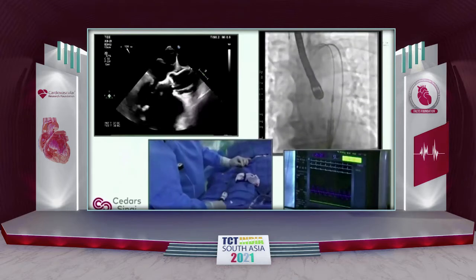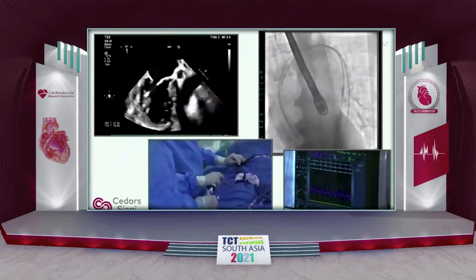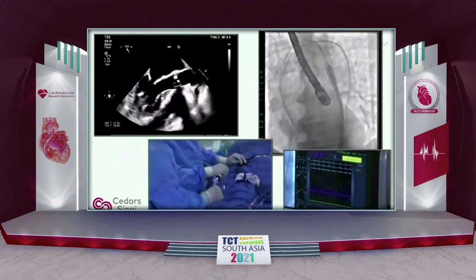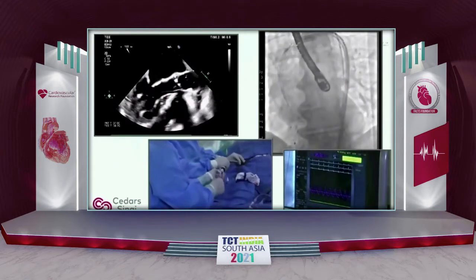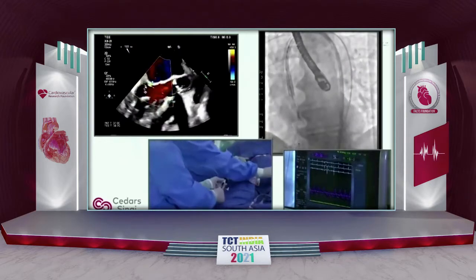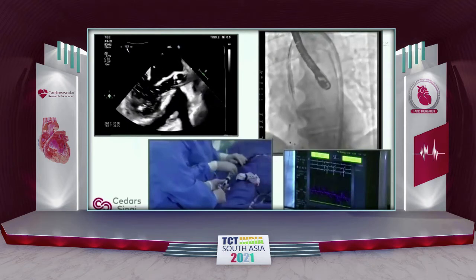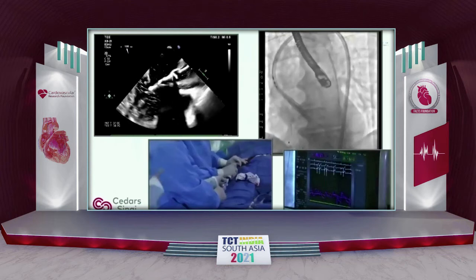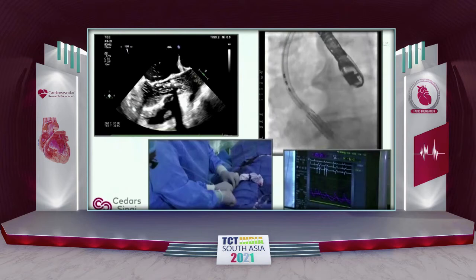You cross so easily with the AL, but sometimes it's very difficult to advance the catheter in, or very high gradients. We'll maybe pre-dilate those patients, but we're still in a vast majority, maybe 10-15% of pre-dilation. Raj, I don't know where you're at. I think we are where you are, about 20% of the times max.